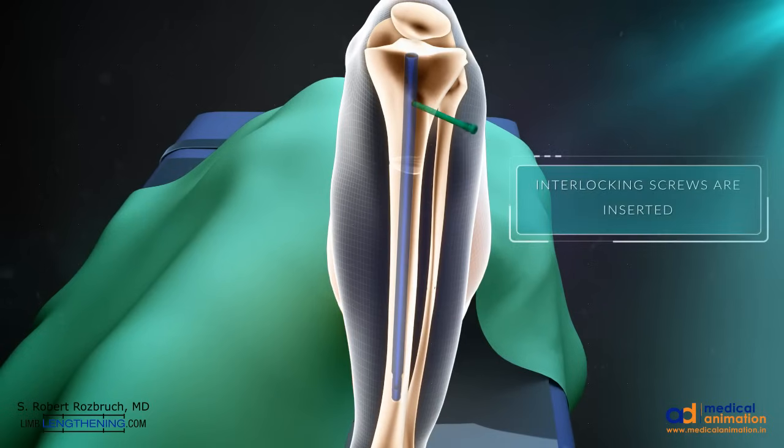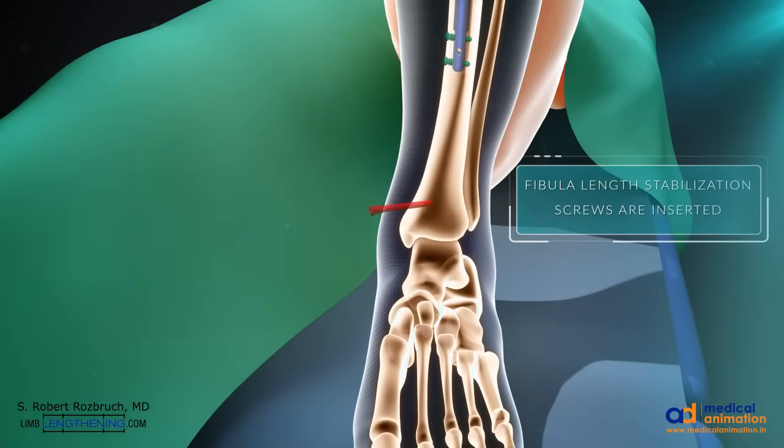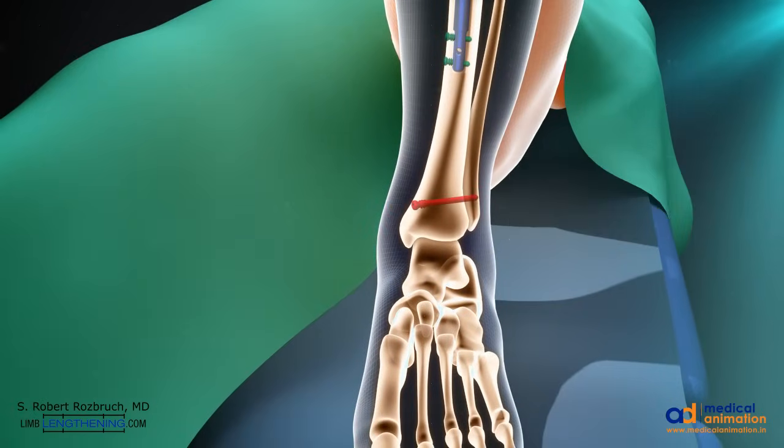Interlocking screws are then inserted proximally with the use of a jig, and then distally they are inserted using a freehand technique. Fibula length stabilization screws are necessary during tibia lengthening to make sure that the fibula lengthens along with the tibia. Two screws are placed, one proximal and one distal.